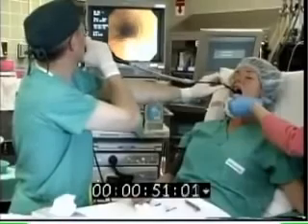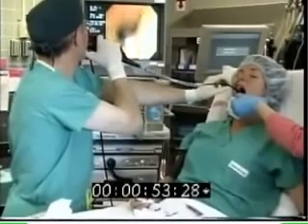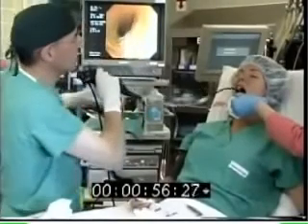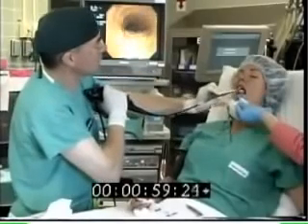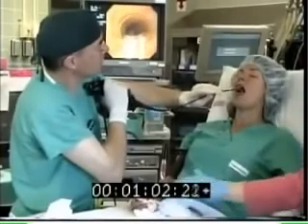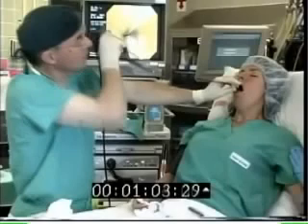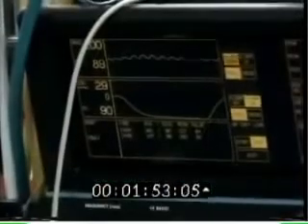As the scope is advanced through the larynx, the patient is again instructed to take a deep breath to maximally abduct the vocal cords and thereby facilitate passage of the scope. Having positioned the tip of the bronchoscope in the trachea, the practitioner should advance the endotracheal tube over the scope to follow the natural curve of the airway. As the tube is advanced, the patient should be instructed to take a deep breath to maximally abduct the vocal cords. The correct position of the endotracheal tube is confirmed endoscopically before the scope is removed, and can be further confirmed by movement of gas through the circuit and capnography.